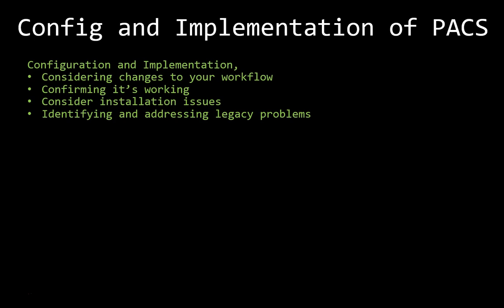The biggest installation issue you will encounter is in the tables you have to build. There's a significant amount of time that goes into creating and keeping various codes in sync between different systems. Codes will need to be established for many parts of your system, as simple as a set of protocol codes to much larger sets of data such as procedure codes. These codes are typically kept in sync manually. If they are out of sync, the PACS may not accept data.